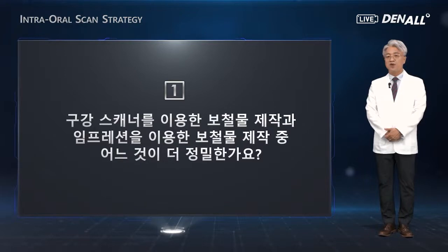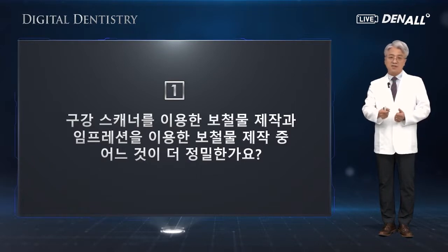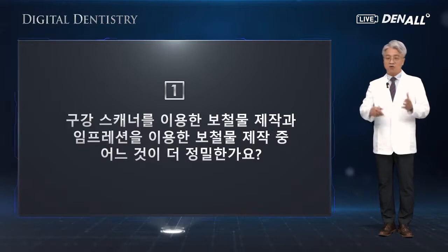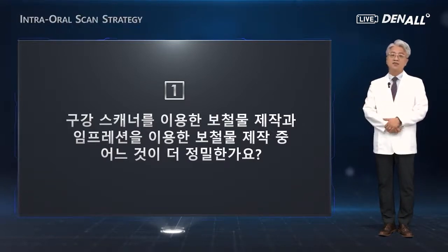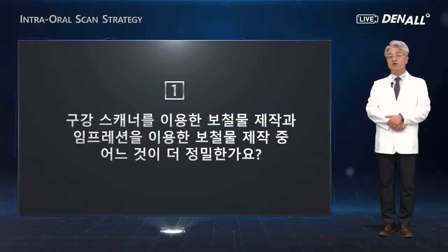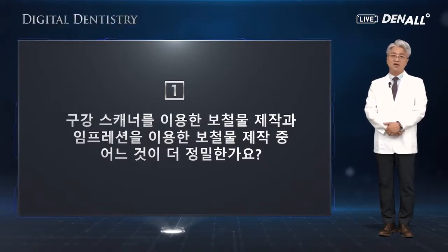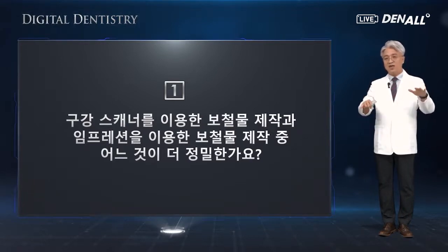There are some reasons on my part. First, the rubber impression taking or stone pouring has expansion and shrinkage errors, and depending on who works on the rubber impression taking, depending on the staff, the precision level would be different. There is a seasonal variance as well as errors in the model pin work. The mounting on an articulator also makes so many errors. So in the Modeless approach using an oral scanner, there is only one type of error associated with the oral scanner.